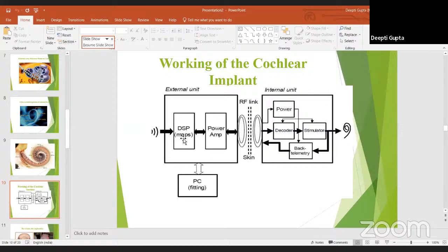Because, as I have discussed in the picture also, cochlear implant users don't have all kinds of frequencies like a normal hearing person, because definitely something is missing. That's why they are using the cochlear implant, whether in the outer part, the middle part or the inner part of the ear. Something is missing. So they have to compromise on some frequency levels.